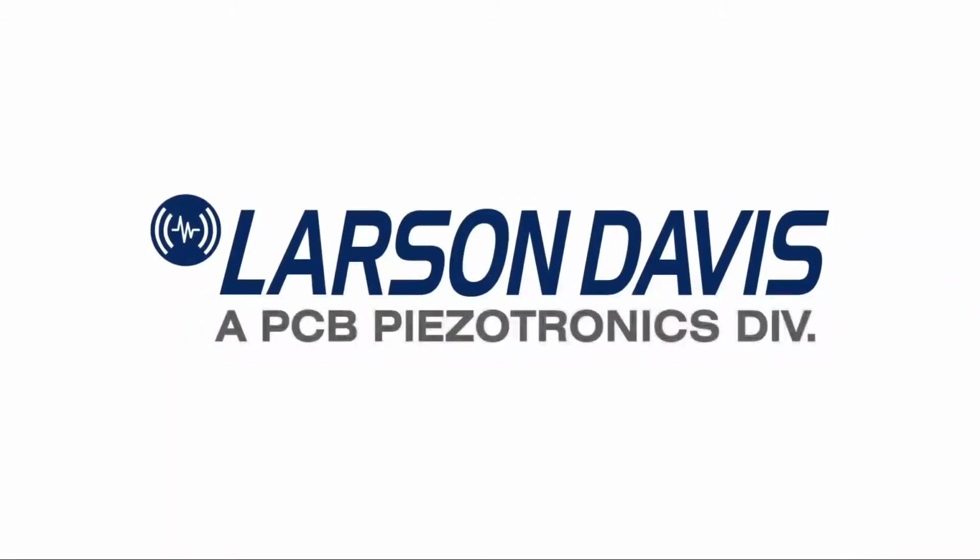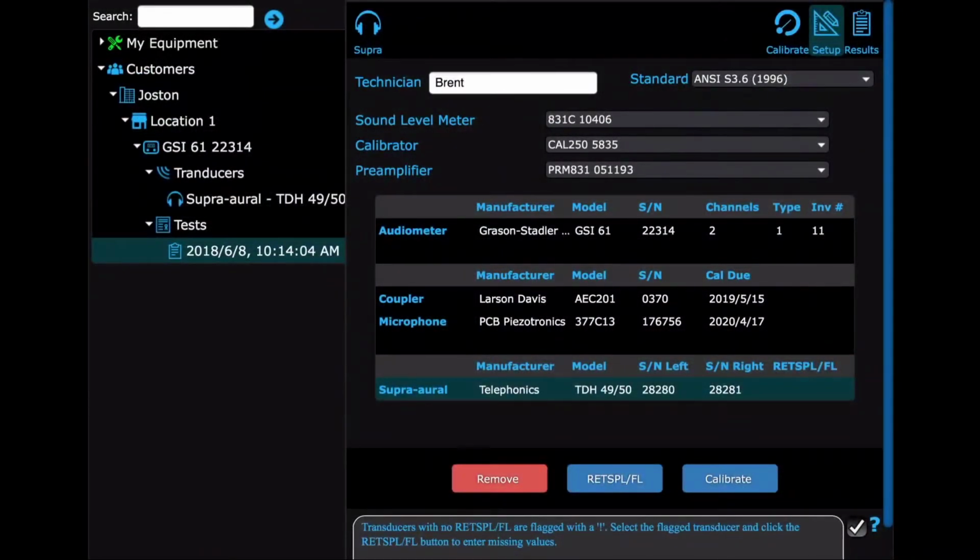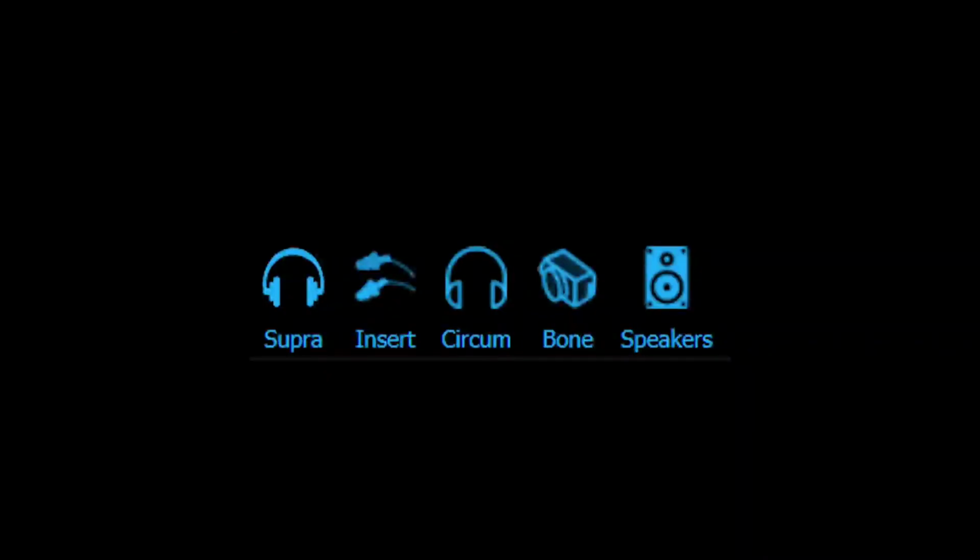In this AudCal tutorial, I'm going to show you how to test an audiometer using the AudCal app. To begin running a test, have the test you created selected in the tree view, then select the transducer icon you want to test first. Here we only have one, so it makes it easy. If you had other transducers, they would look like this.